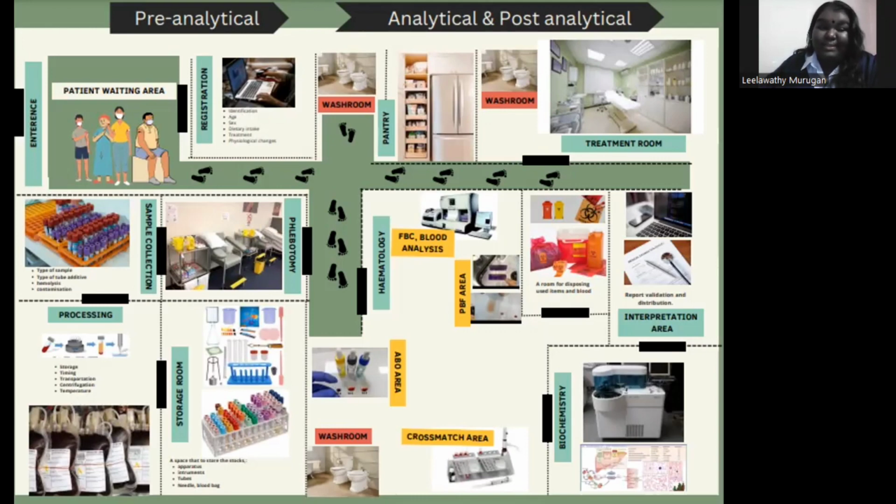So as soon as you enter the door, you'll be facing an entrance. There will be a patient waiting area. So patients can come and wait for their turn while they can register as well. In this registration, staff will be taking the identification of the patient in terms of age, sex, dietary intake and treatment. Also physiological changes so that we don't give a wrong treatment.